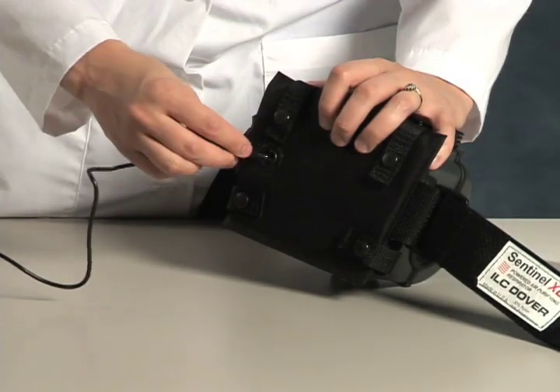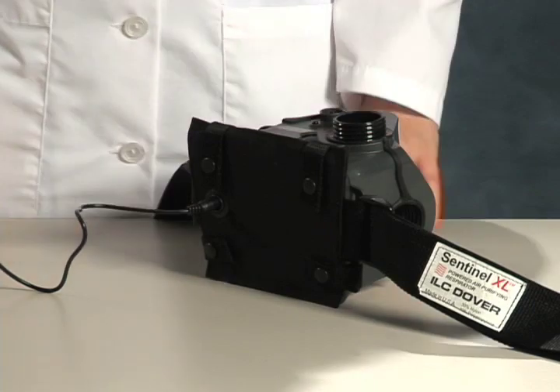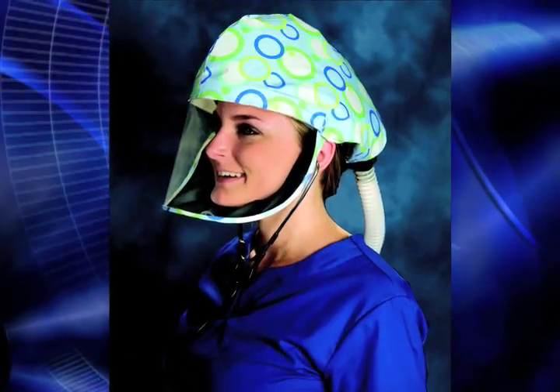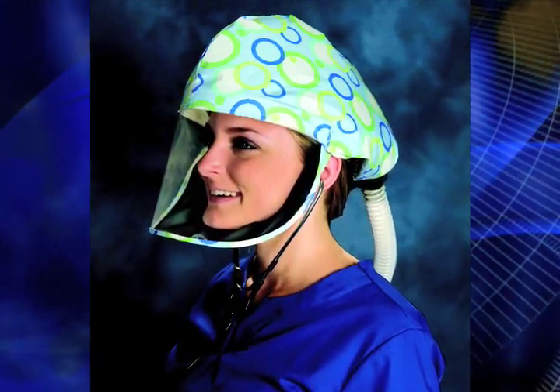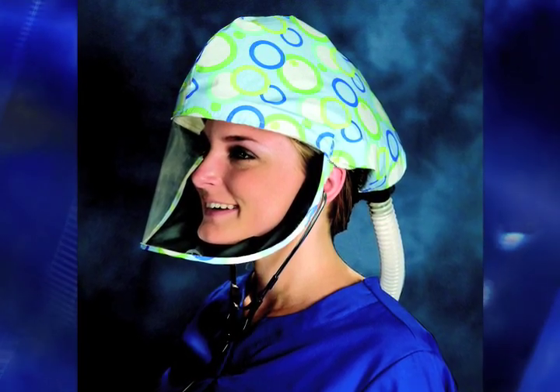The Sentinel battery can be charged through the waist belt using the charger provided in your kit. A premium head cover called the BioShield is also available with the HP system. Produced from ILC's durable ArmorFlex material, its colorful print design creates a truly patient-friendly product.